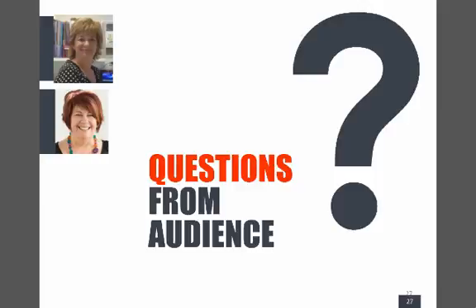So that's a great lead into Lisa's question, which is about the no smoking, for 2 hours before doing a spirometry. What are your thoughts about that? Ideally, yes. However, it doesn't often happen. If somebody's a smoker, you often find that they will come in.